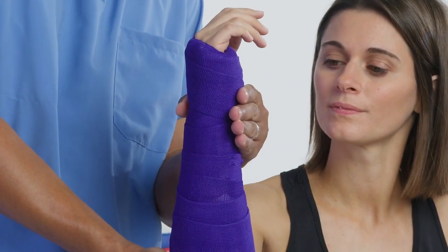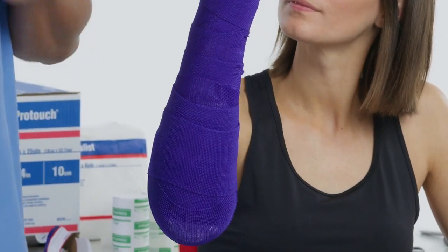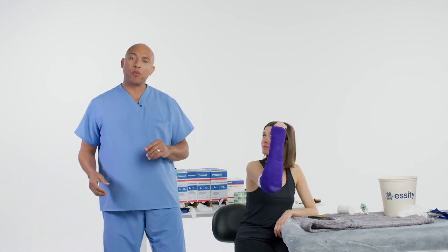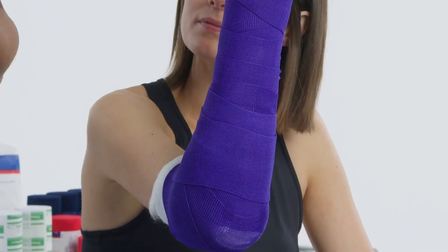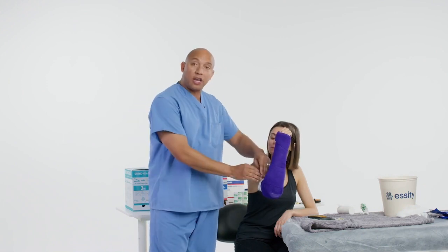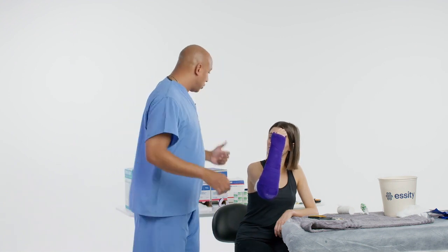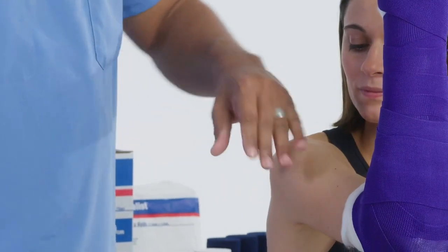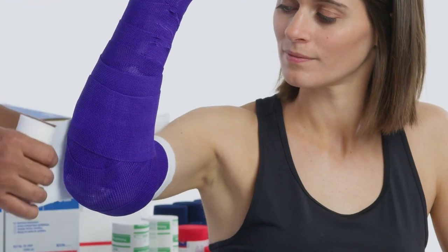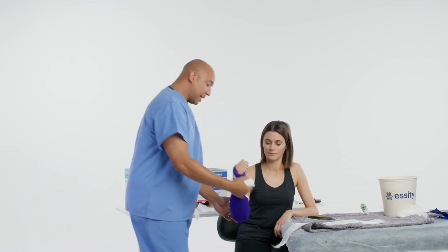What we have here is the reverse sugar tongue, with the patient at 90 degrees. Since we made our padding high enough, you can now add the double sugar tongue if you want to stop extension of the elbow. When I put my padding on originally, I placed it a little bit further just in case I needed to add the double sugar tongue — your padding should extend further than your elastic bandage so you don't have to undo it to add more. The measurement for the double sugar tongue goes from the shoulder or tuberosity area all the way down into the axilla.